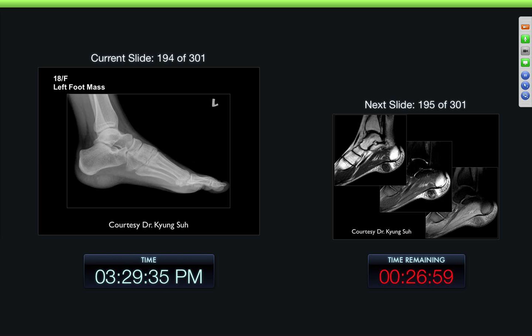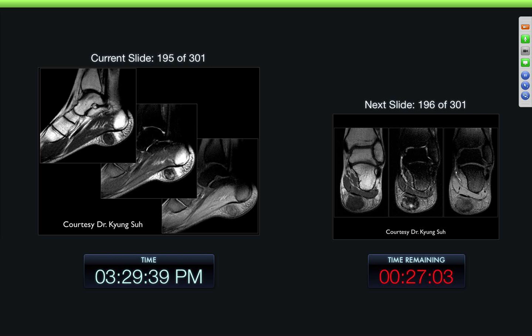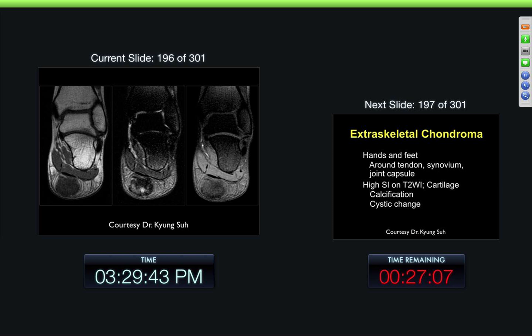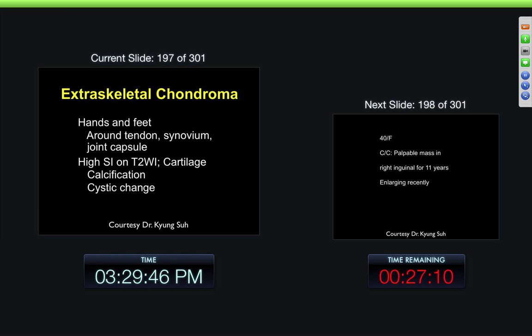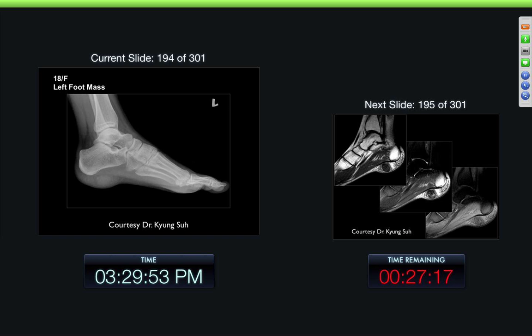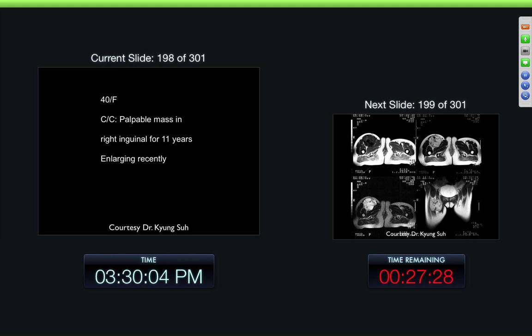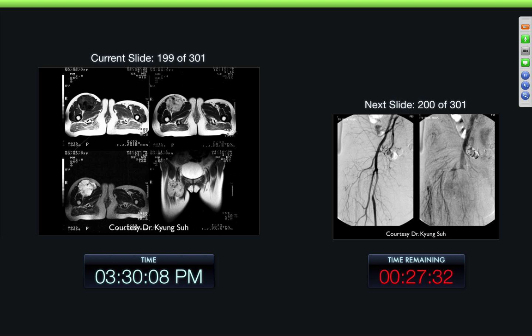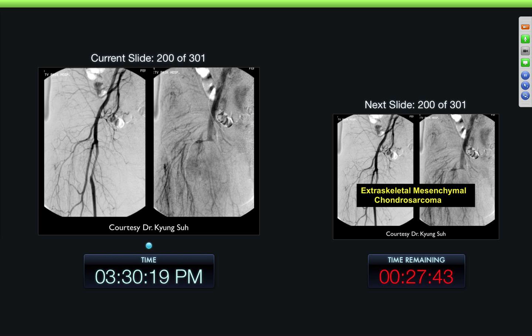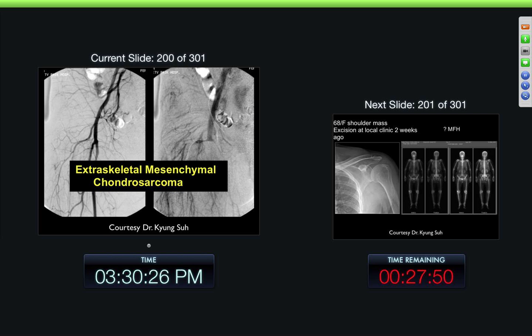18-year-old female, left foot mass. Here we can see the mass in the plantar aspect — fairly low signal intensity, a little bit inhomogeneous. This turned out to be an extraskeletal chondroma that was low in signal intensity, probably because it has a lot of fibrous tissue in it. May have a little bit of poorly defined calcification but probably mostly fibrous. 40-year-old female, palpable mass in the right inguinal area for 11 years, recently enlarging. Here we can see this mass — fairly a little bit scalloped margins, sharply defined but internal characteristics with a lot of internal septa and inhomogeneity, with mass effect on the vessels. This was an extraskeletal mesenchymal chondrosarcoma.